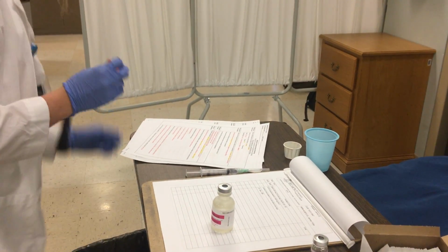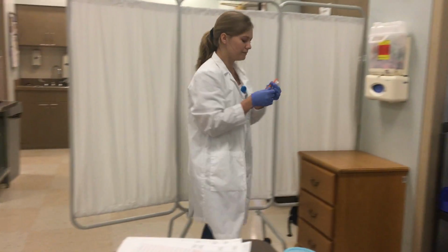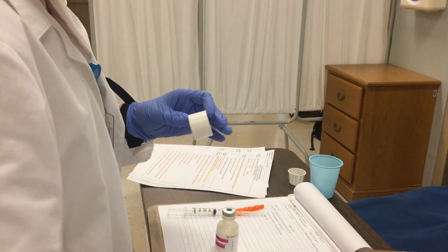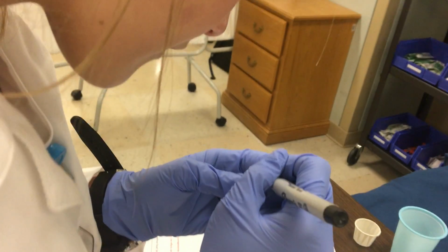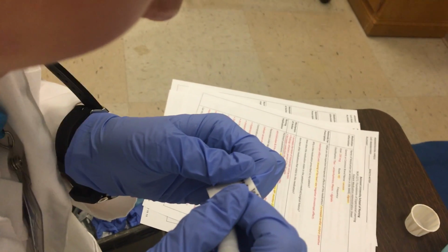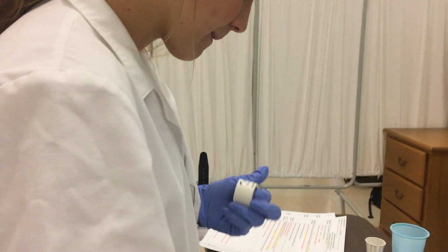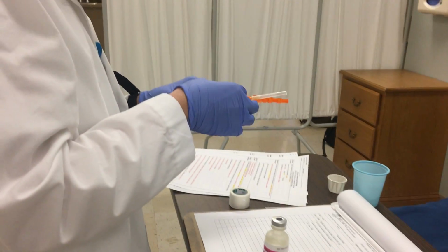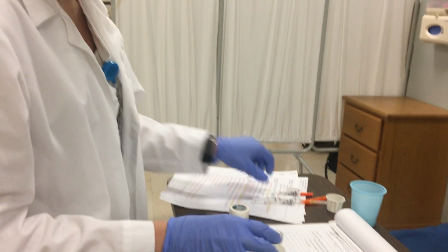And I'm going to label my syringe. Okay, so I've got my meds.